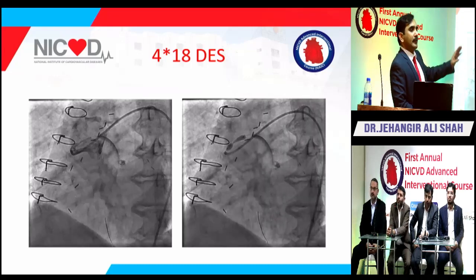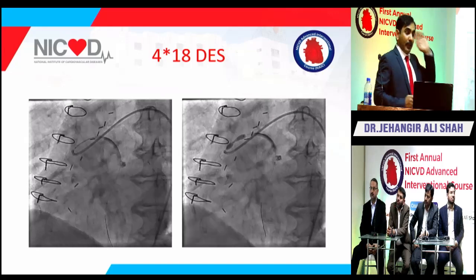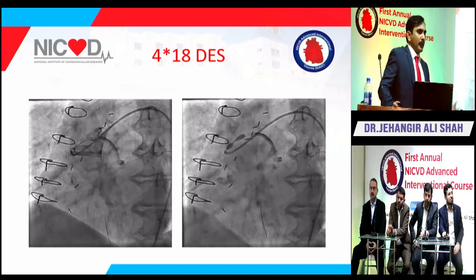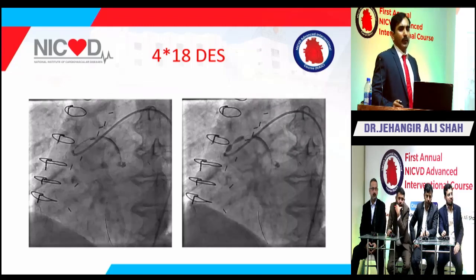So another option is the Szabo technique, which was used to cover the ostium. You put a wire in the proximal struts of the stent and just keep the wire inside, in the aorto-ostial lesion.